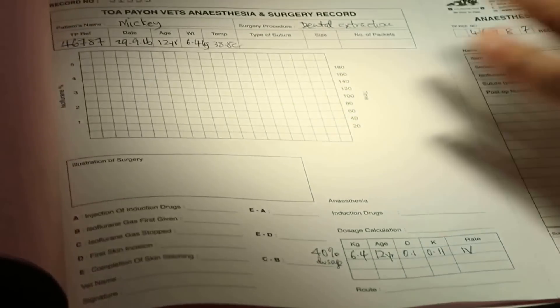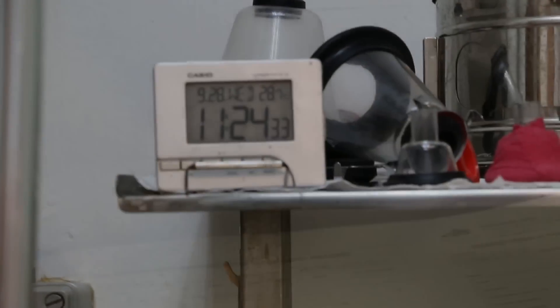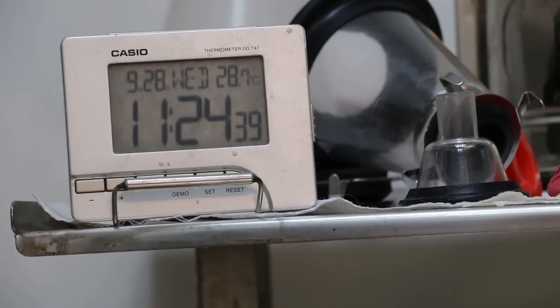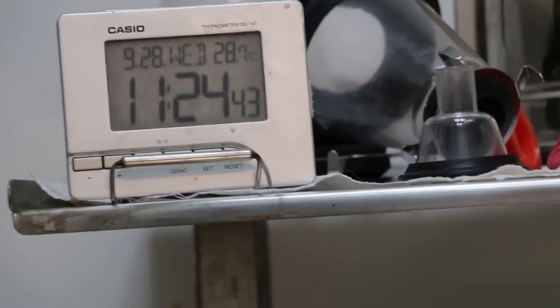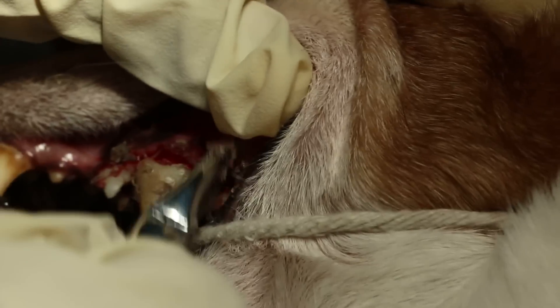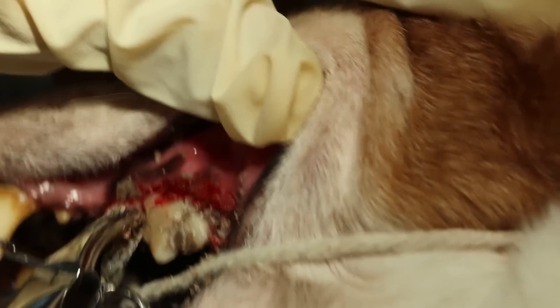11:21 AM, I intubated the dog, which is three minutes after the IV Domitor plus ketamine at 50% diluted with normal saline. Now we are doing the dental work — we try to extract any rotten teeth first. The dog is at 2% maintenance isoflurane, flow rate about two to three liters per minute oxygen. You can see this molar is definitely very bad — it's loose — so we slowly loosen it and extract it out.